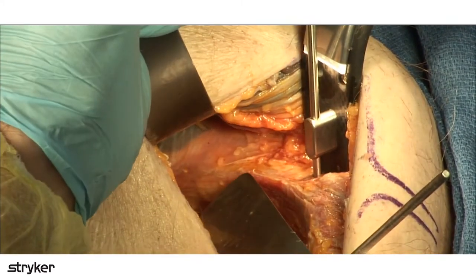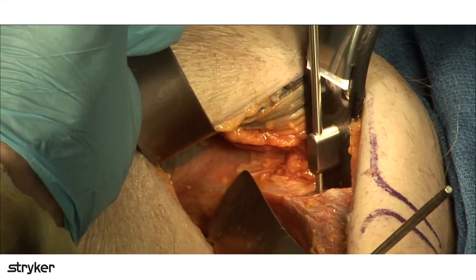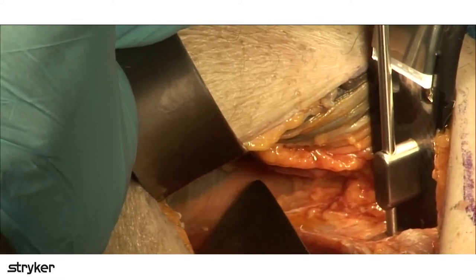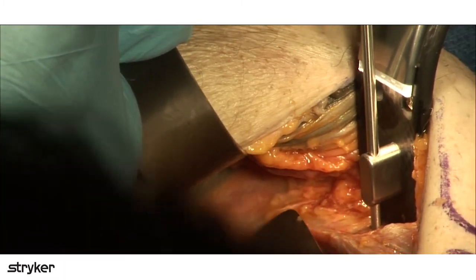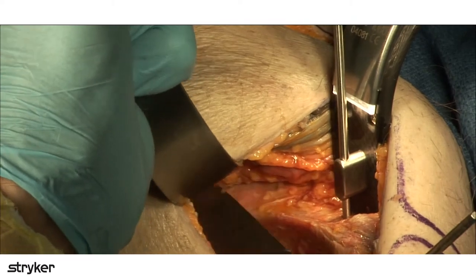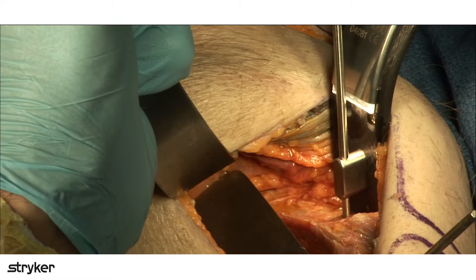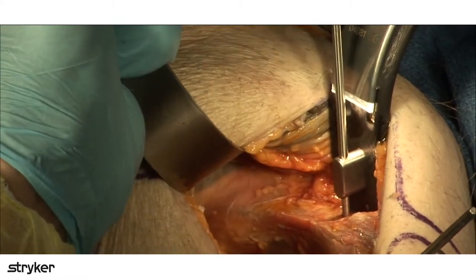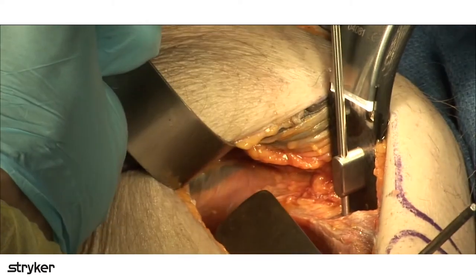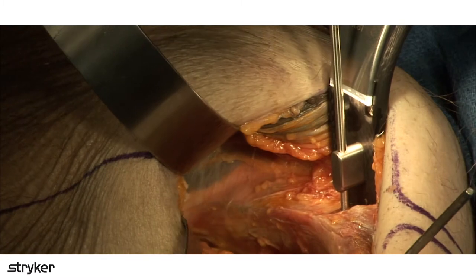So this here, that dark structure that you see there, that is not the external iliac vein. That is the iliacus muscle. All right, when people see that, especially when there's hematoma in there, they get a little scared and they think that's external iliac vein. The external iliac vein is on top of it right here, and it's loose, and you can see external iliac vein right there. So it's really important to figure out what you've got and what you're retracting. So when you're the guy putting the retractor in, you really want to make sure that you get in underneath the external iliac vein like that.